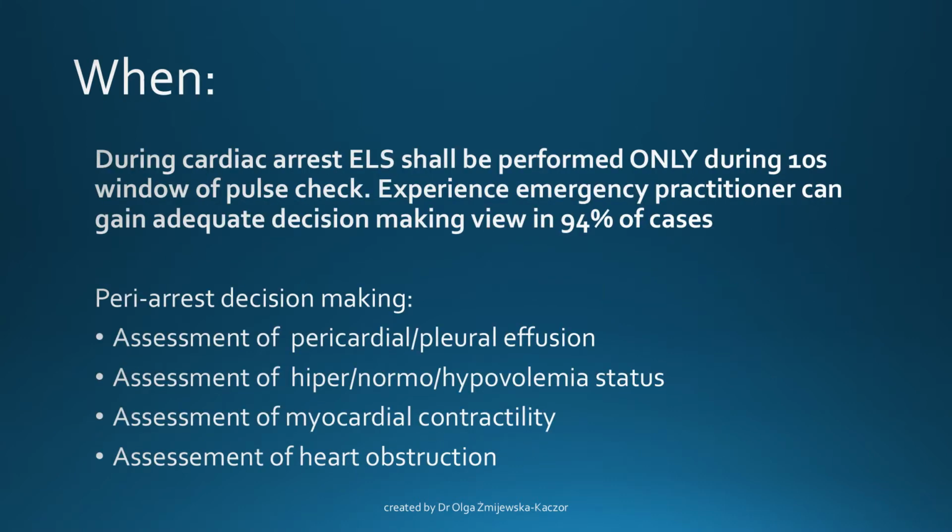When you think about ELS during cardiac arrest, it can only be performed during the 10 second window of the pulse check. However, please don't be discouraged. An experienced emergency practitioner can gain an adequate decision-making view in 94% of cases. So that's quite a significant thing.